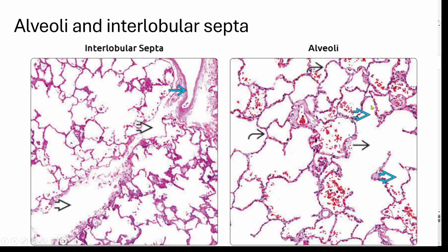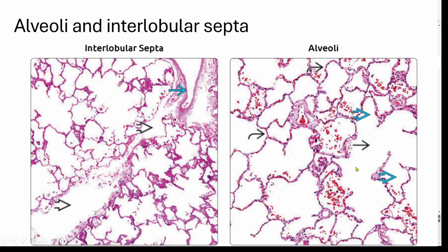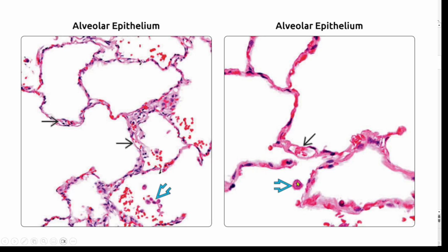Alveoli. So this is an alveolus. This is the alveolar duct. As you can see, this is branching from the respiratory bronchioles. So it's just a space, and the acinus is just a space again. They are outlined by pneumocytes as well as endothelial cells and inhabited also by macrophages. This is a macrophage here. This is a capillary wall, and this is an endothelial cell.